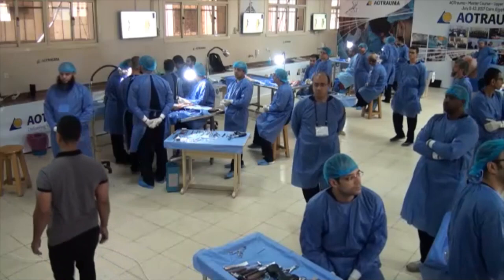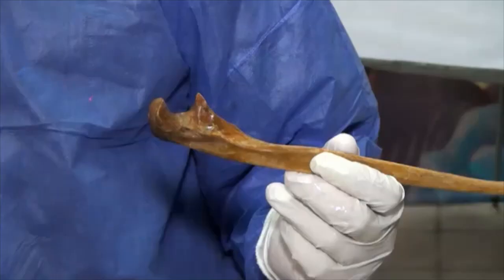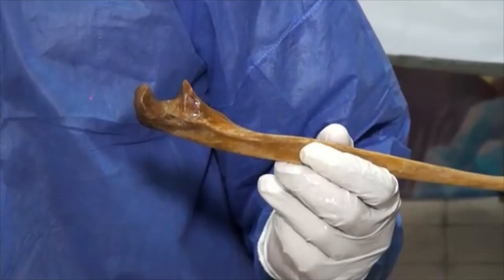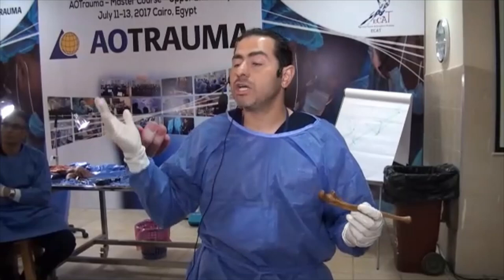The technical point here is on the ulna: there is a small bare area on the ulnar side, and you need your cut to be in this area. Your saw must be perpendicular to this area — if the saw is angled, you will exit either below or above the correct area.